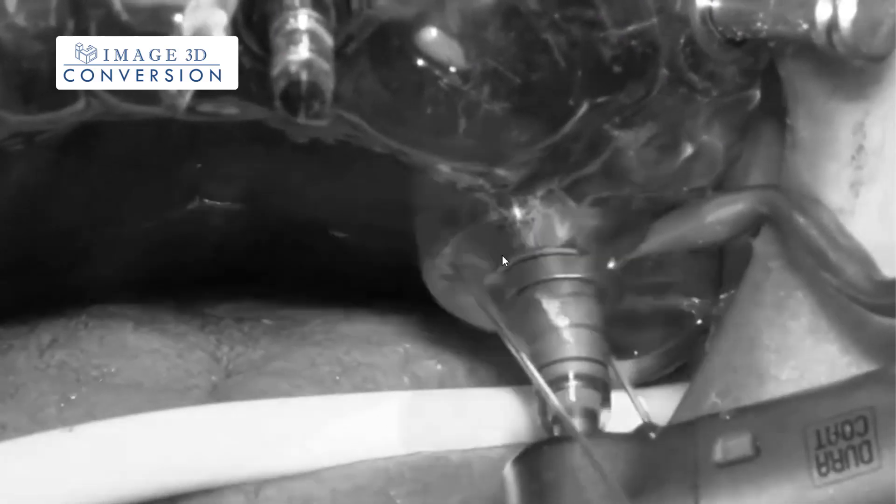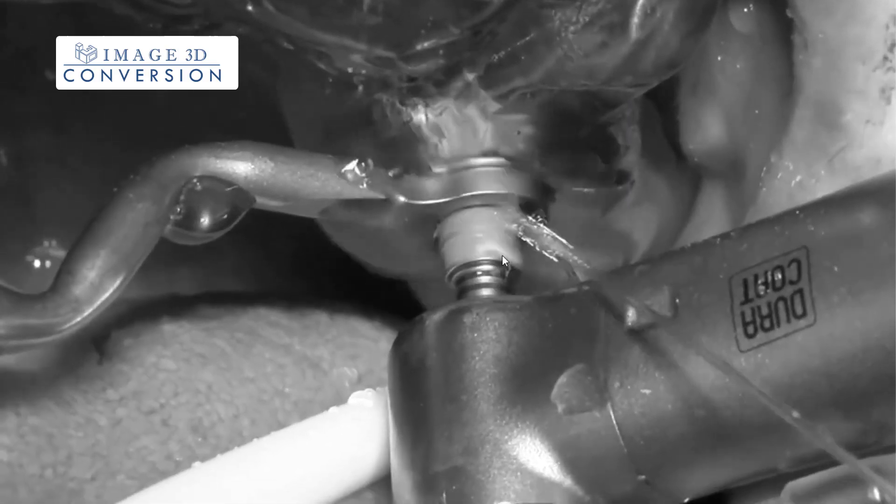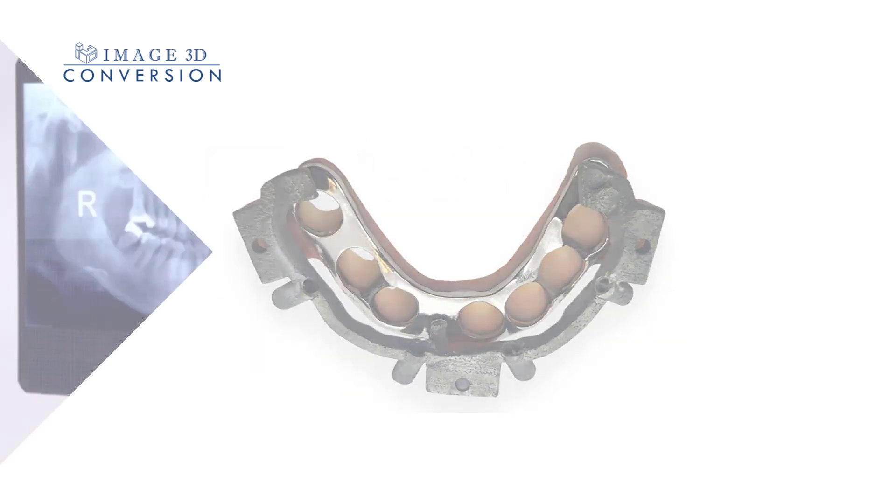Our surgical guides are custom-made for each patient, ensuring a perfect fit and precise implant placement. They are made from high-quality, medical-grade metal and created using the latest digital technology.